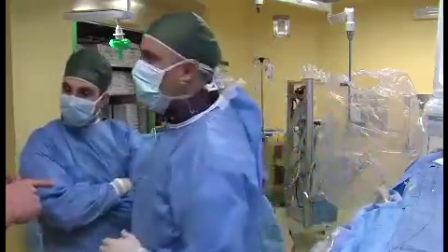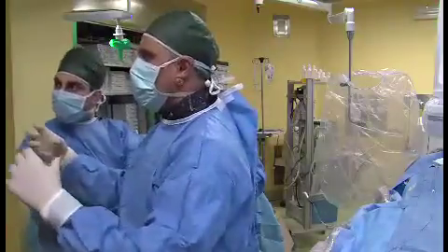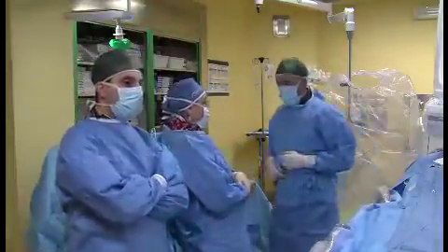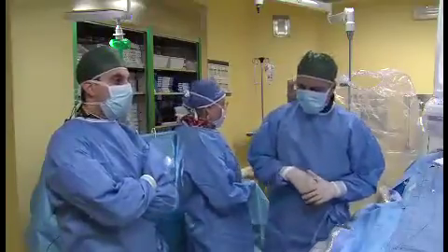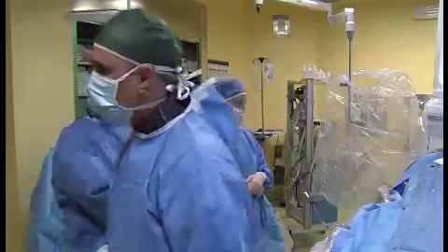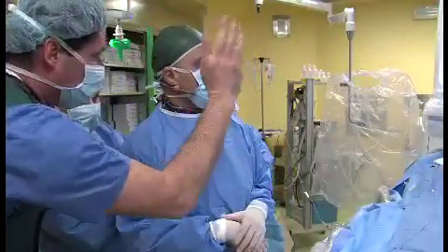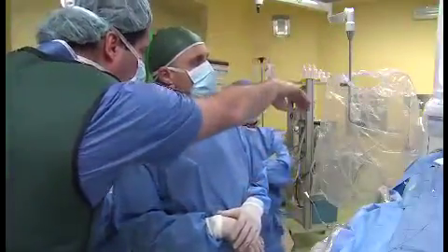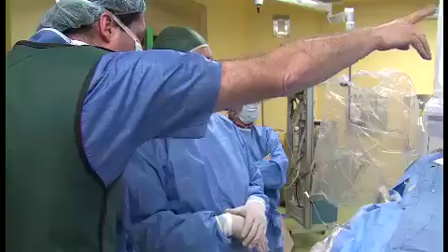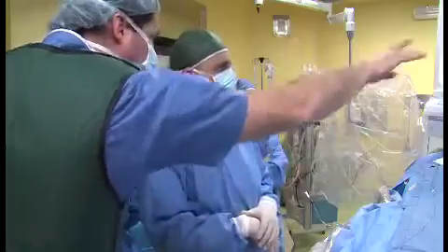So just say again, the pulmonary regurgitation is mild, with prevailing obstruction and moderate pulmonary hypertension, which is not unusual, especially in multiple operated patients with, maybe, pulmonary and MAPCA reconstruction. You do have half or two thirds of systemic pressure in the pulmonary beyond the obstruction. Is this a contraindication? I see that in Dr. Eiken's lecture, among the 6 patients who died, 2 did have pulmonary hypertension.